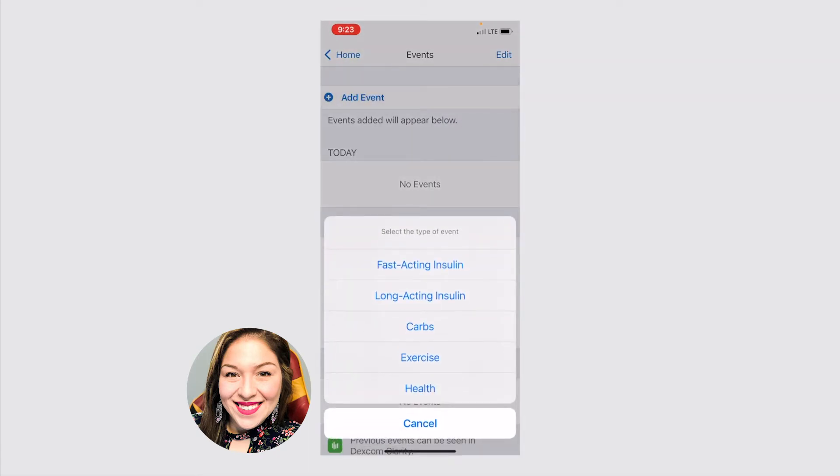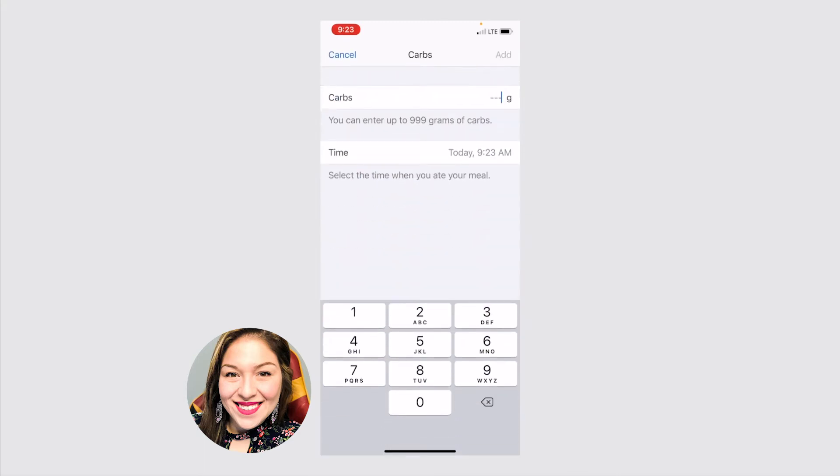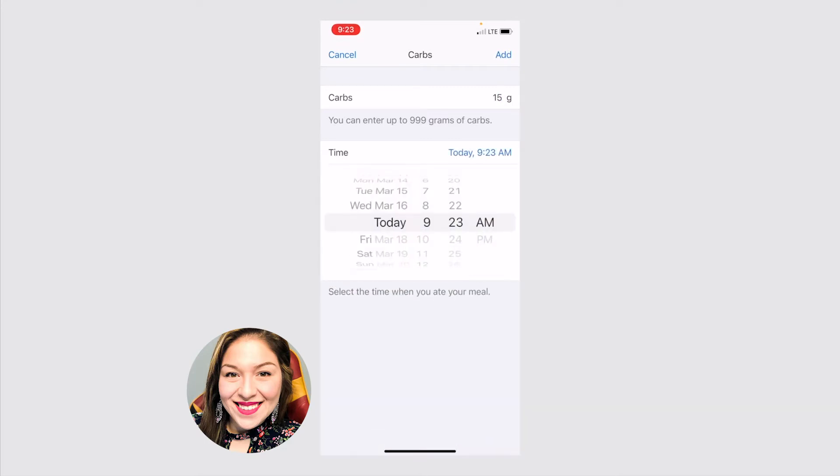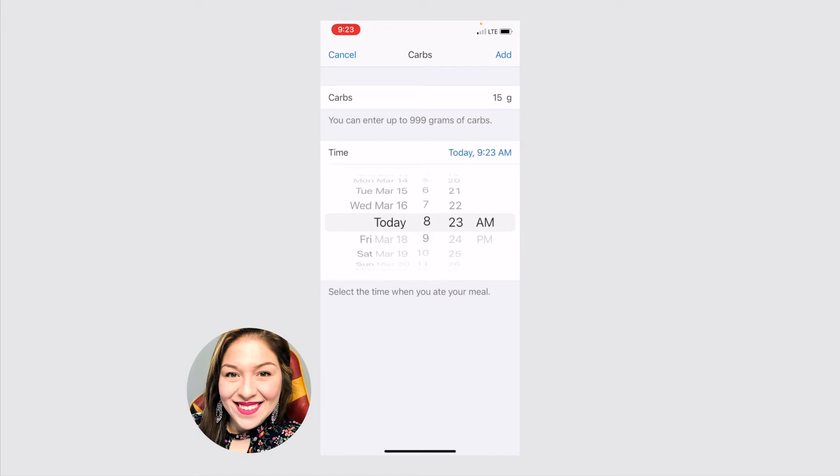Another event is carbs. If you're carb counting, you can put in how many carbs you had for a meal. Let's say I'm having breakfast soon. So I know at like 10:30, I'm going to have about 15 grams. I guess you can't put it ahead of time. You can only put current time or backtrack. So that's good to know.